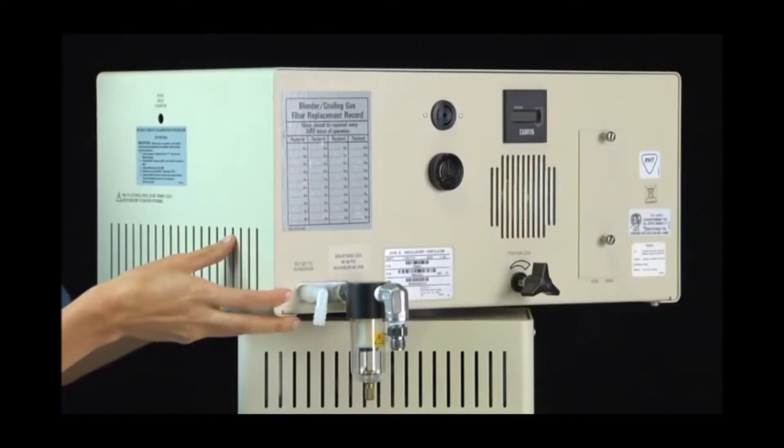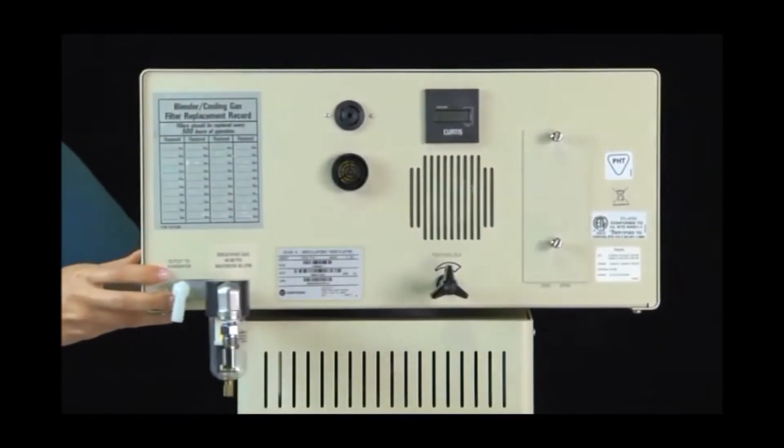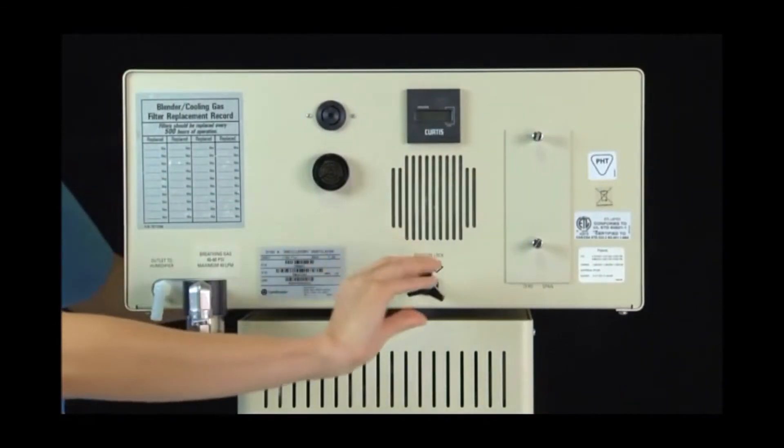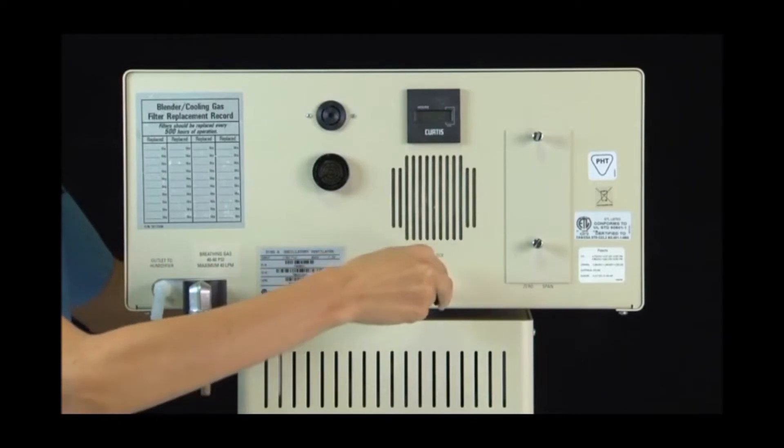The head of the ventilator may be turned 270 degrees for optimal viewing by the operator. To lock the head into place, turn the position lock clockwise.